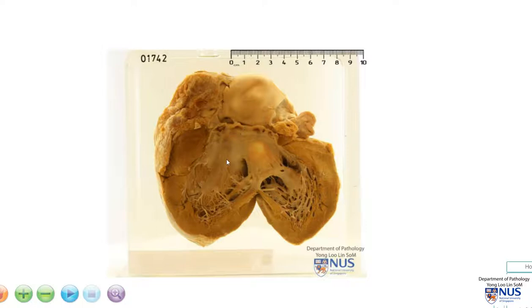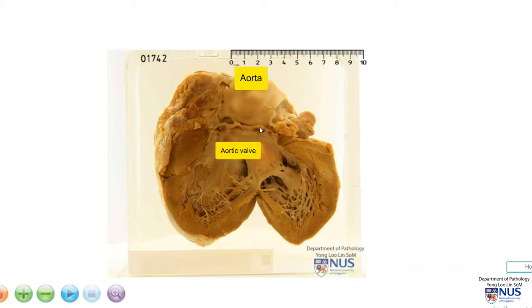Hello, this is a specimen of the heart and we are looking at the left ventricle which has been opened. This is the aorta, this is the aortic valve which is very abnormal, and over here is the region where the mitral valve leaflets are, where they allow blood inflow from the left atrium into the left ventricle.